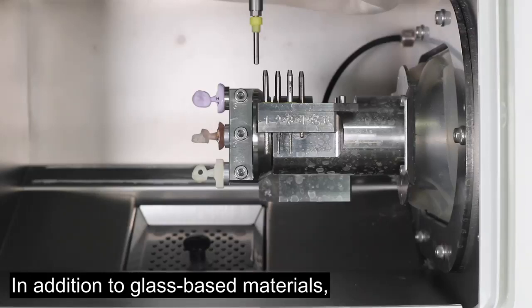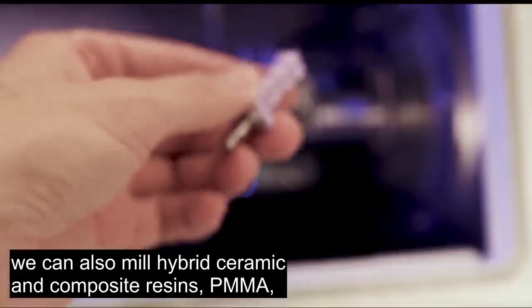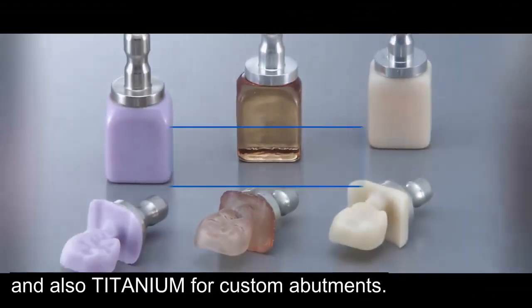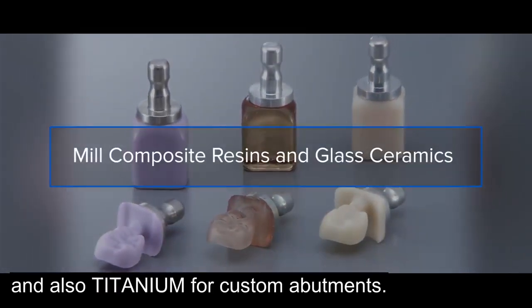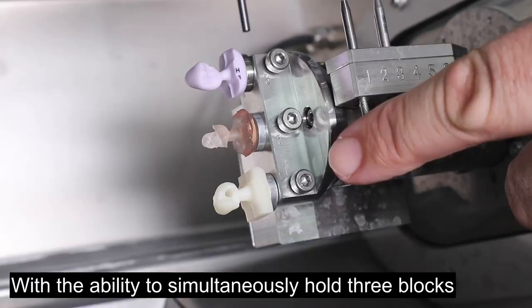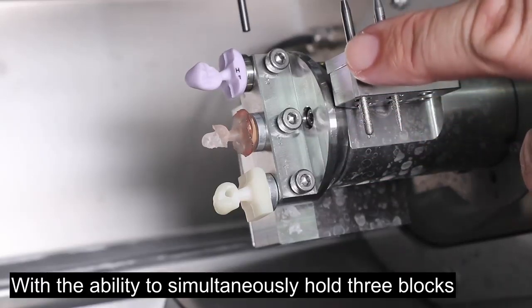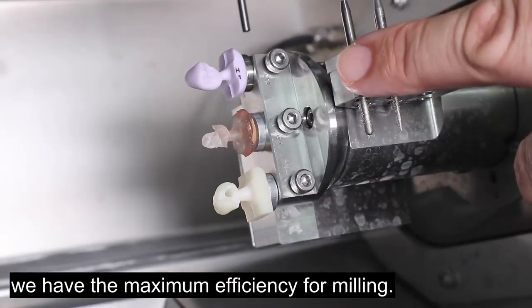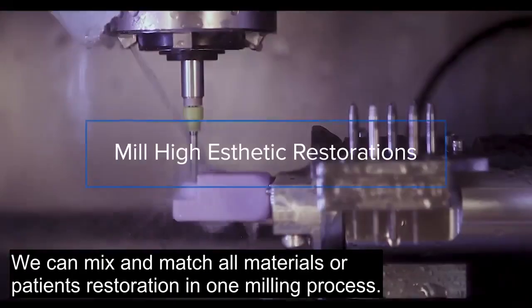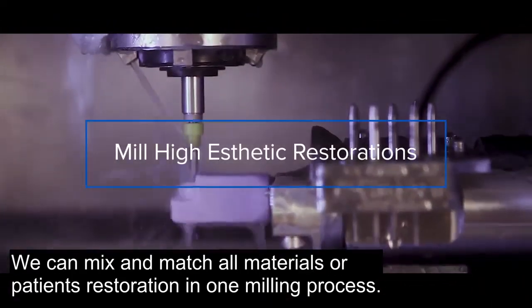In addition to glass-based materials, we can also mill hybrid ceramics and composite resins, PMMA, and also titanium for custom abutments. With the ability to simultaneously hold three blocks, we have maximum efficiency for milling. We can mix and match our materials or patient restorations in one milling process.